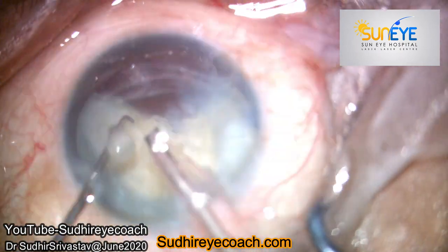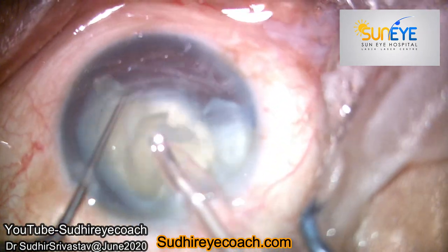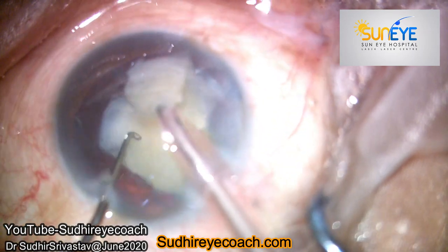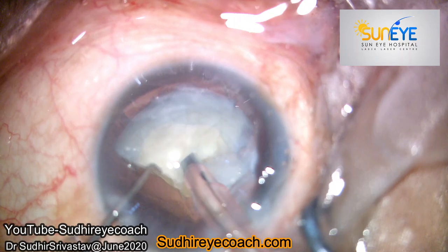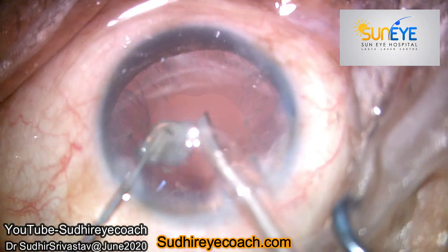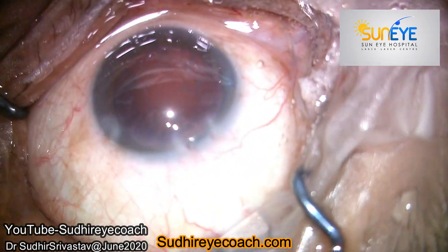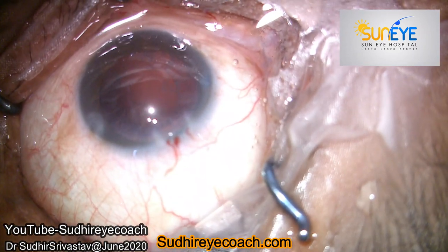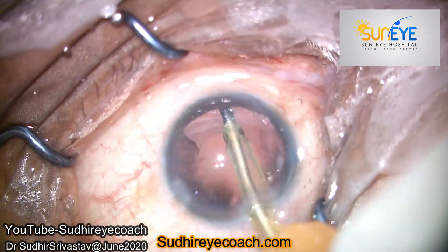I always try to engage the nucleus with my blunt chopper and press it back towards the capsule, and then I try to bury my phaco tip into the substance of the nucleus. With the vertical chop technique I divided the nucleus into several pieces, and without any problem I finished my phaco fragmentation.